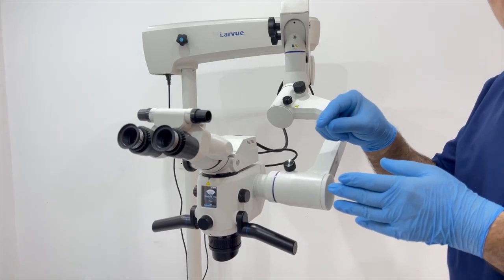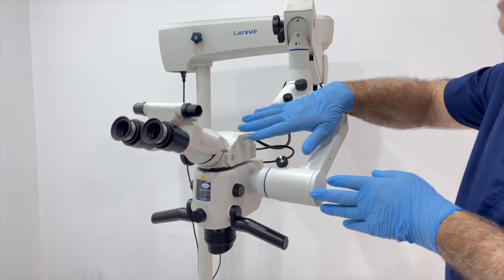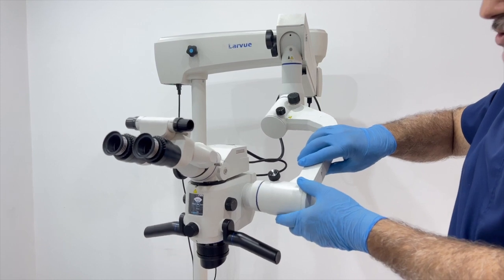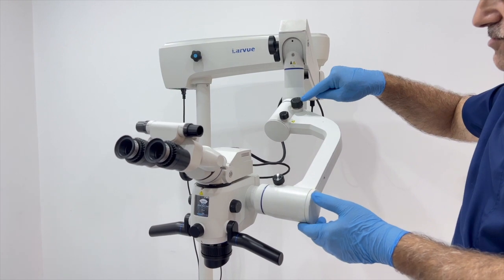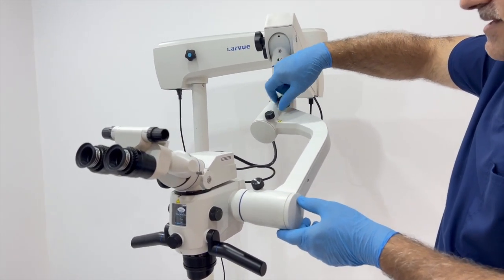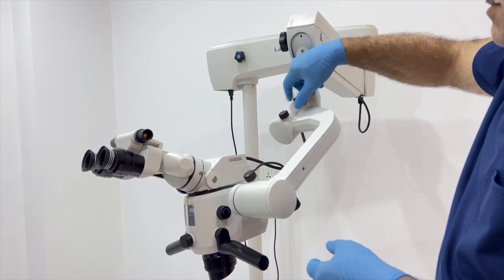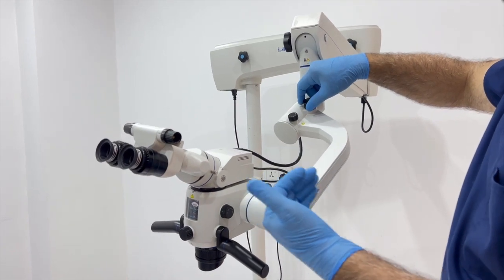This is the second episode. I am talking about balancing of the head of the microscope, then balancing of the secondary arm vertically. So about the head of the microscope, what is responsible for the balancing rotation laterally is a balancing screw. So tightening anti-clockwise, for example, makes the microscope tilted to the right, sorry, and tightening the screw clockwise makes the microscope tilted to the left.